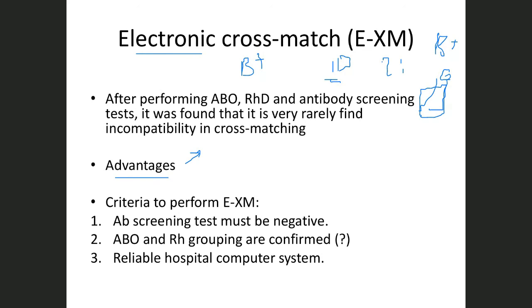What do you think? What's the advantage of electronic cross matching? Cost, maybe. Rapid, yes, excellent. Maybe I will not need too much staff, so I may reduce the number of staff, because I need to do the cross matching examination. As for the unit, I will not open it in any case. But for the staff, it is beneficial because they will not handle it.